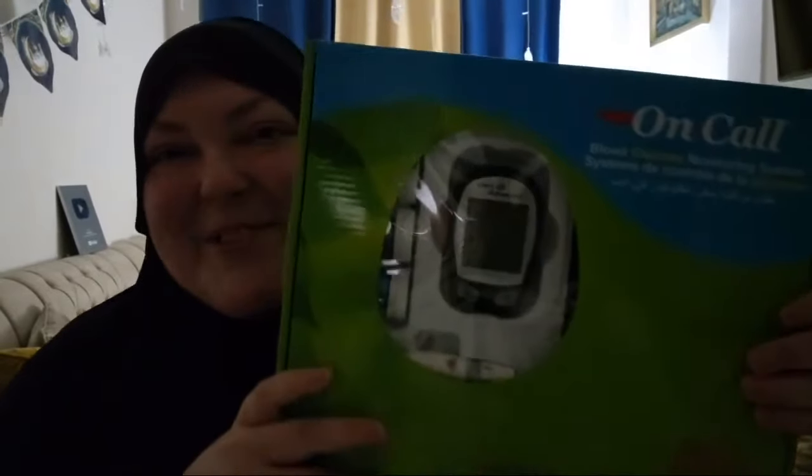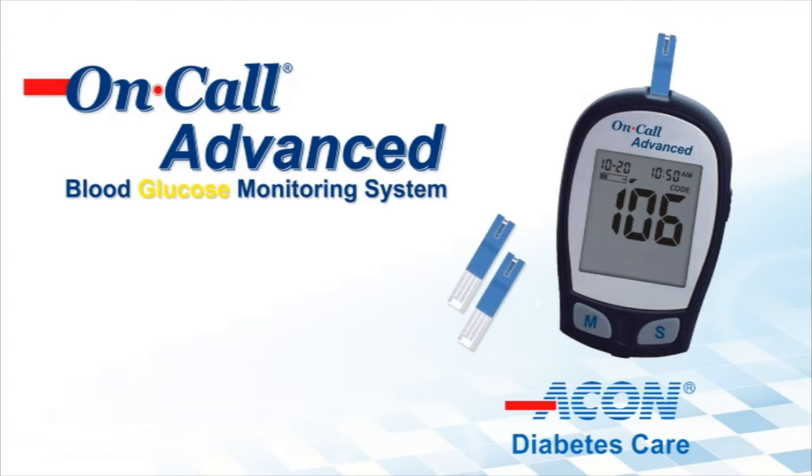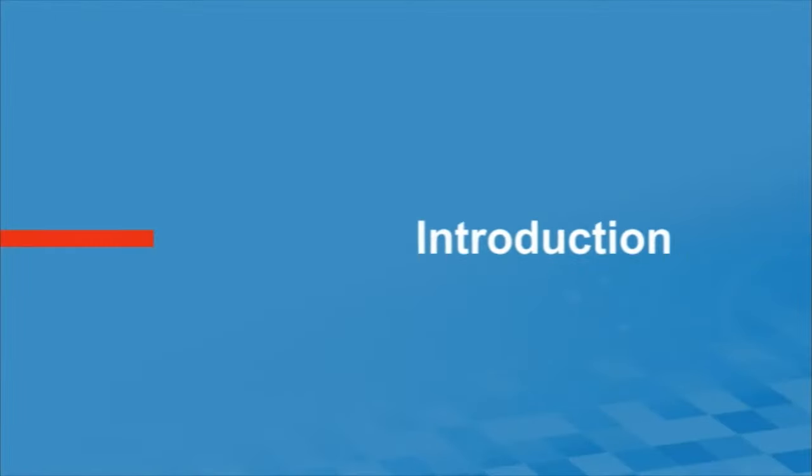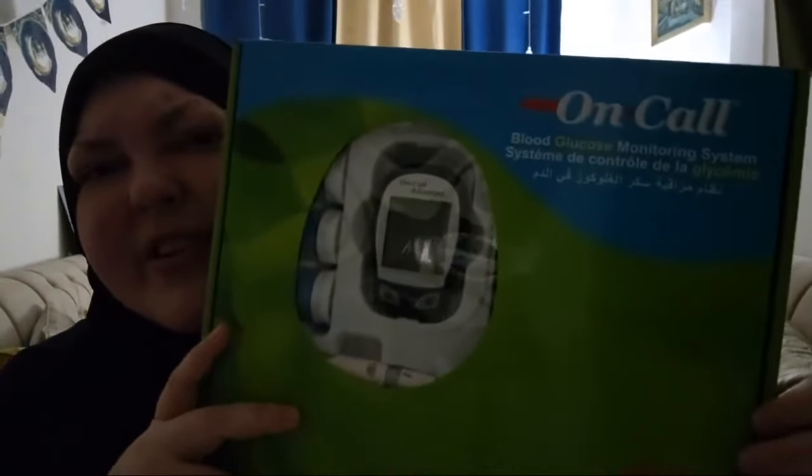So I got a new thing here, a new machine. I'm not turning the light on right now, I'm too tired. I have a thing here — an On Call blood glucose monitoring system — and it comes with the machine.